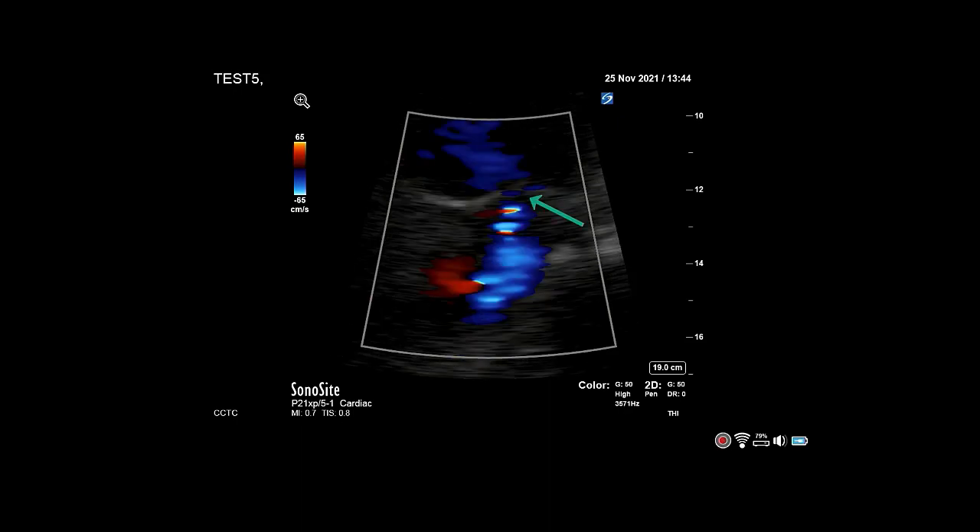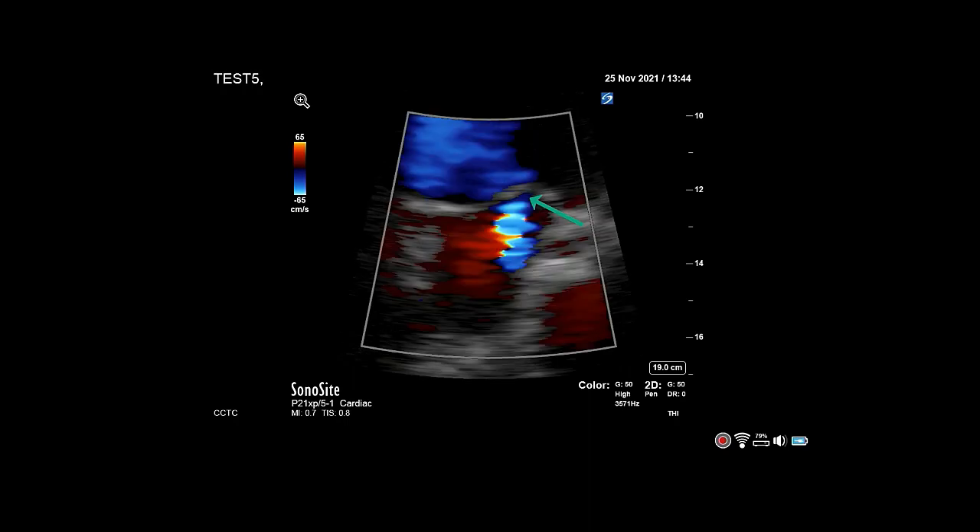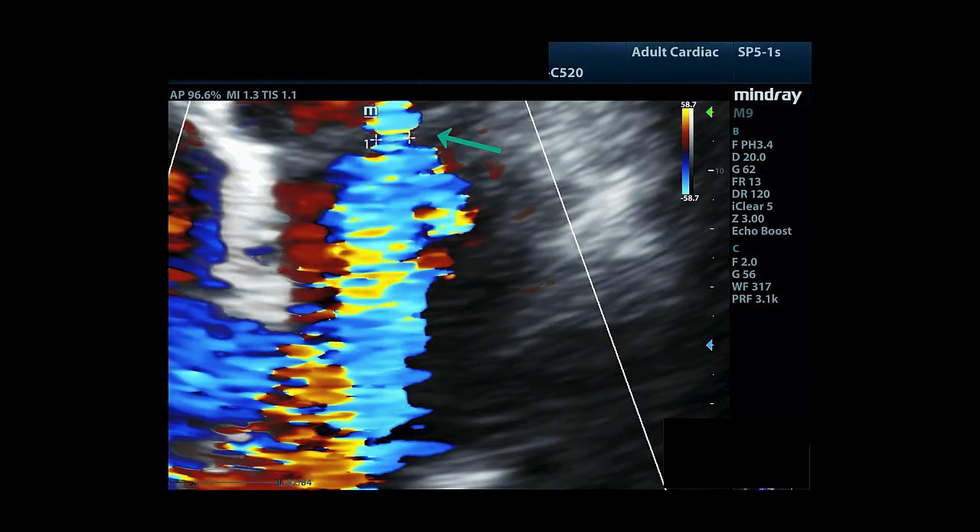This would be similar to the neck of an hourglass. Once you've obtained this image, measure the width of this narrowest part. Mild mitral regurgitation is less than 3 mm. Severe is greater than 7 mm.